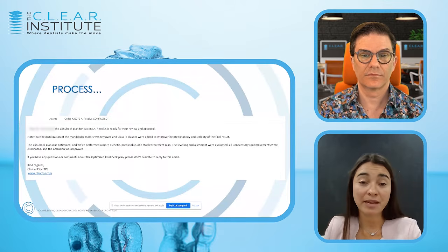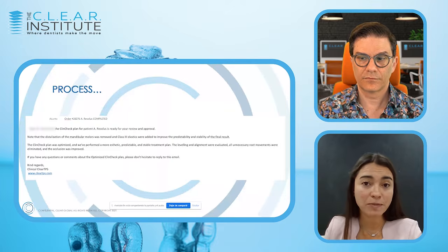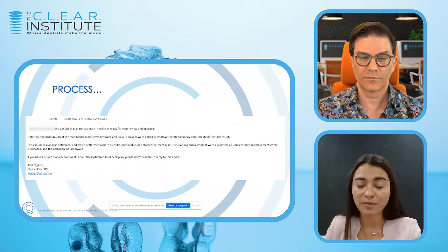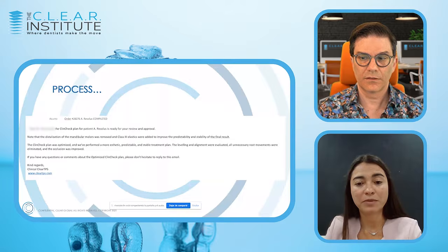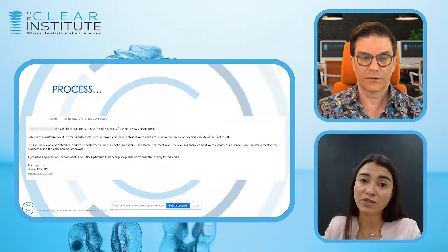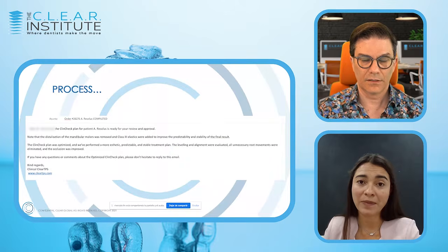And you can send it back saying, please change those attachments, or please add elastics, or give me a call, let's discuss this case, things like that. So always the doctor can feel free to reply to this email if there are questions or further modifications that you would like us to do.